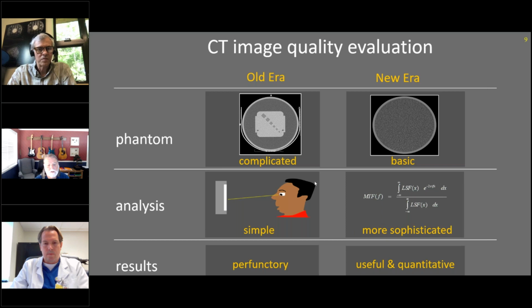For image quality, it's unclear. The state regulations in California say you need to measure image quality, and I haven't read them recently enough to say if they're mandating the MTF, but that's what we would like to have them do.